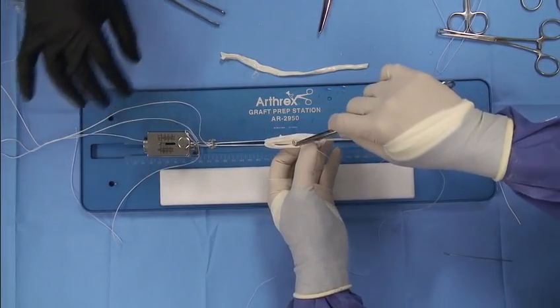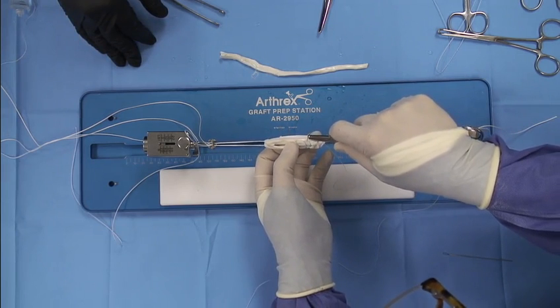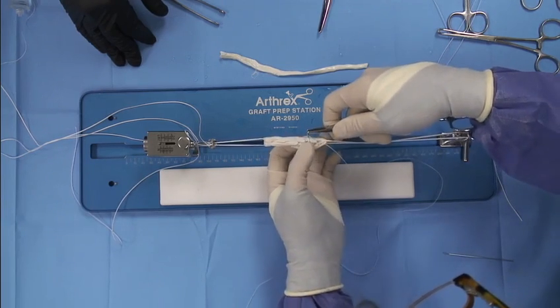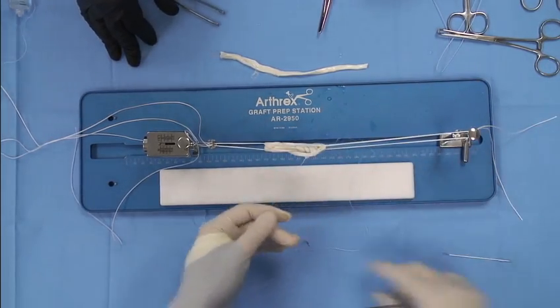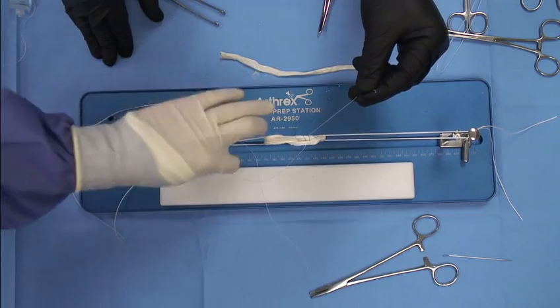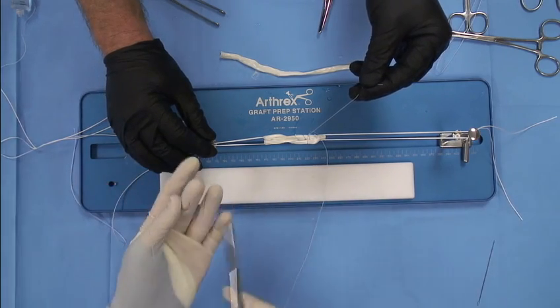If you can see we have one, two, three, four strands. I'm going to start with number two so I can bury the knot. So there's number two, there's number three, here's number four. And now I'm going to have my assistant hold the suture on the end so when I wrap this around 360 degrees, it comes right up flush to that suture and doesn't slip off.